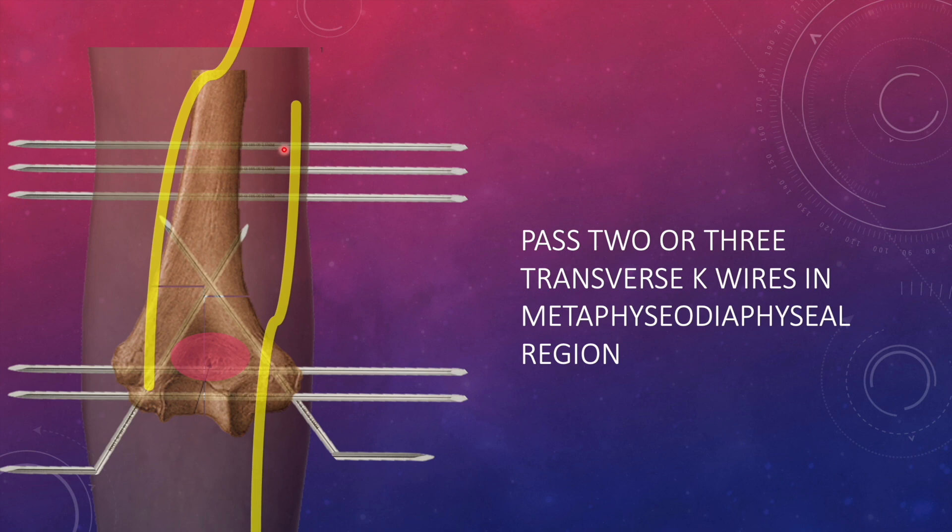You have to lift the skin cover then pass the wire directly under direct vision then enter the diaphysis. On the ulnar side or medial side also, you have to be careful to retract the ulnar nerve anteriorly while passing the wire then make them exit through the skin cover. Once that is done, you are ready with your diaphyseal and metaphyseal assembly.